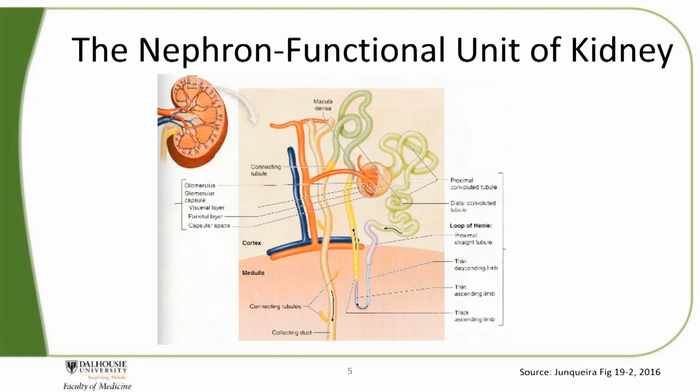The nephron is the name we use for the combination of structures that carry out the functions of the kidney. Kidney physiology is highly complex, and we are only reviewing the names of the structures that compose the nephron. To give you context when compared to the previous drawing, the top beige region is the cortex and the lower orange area is the medulla.